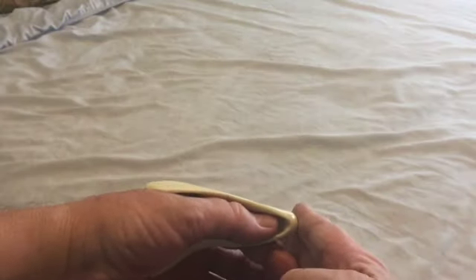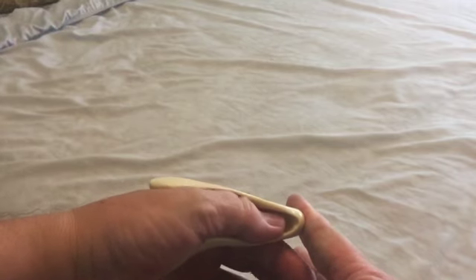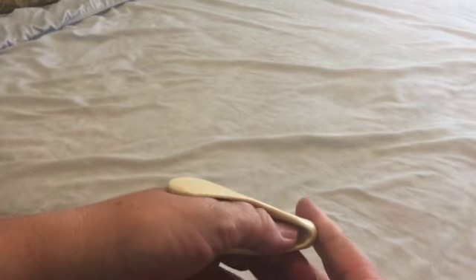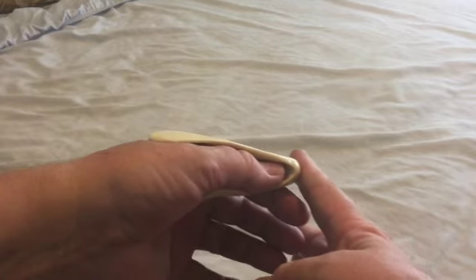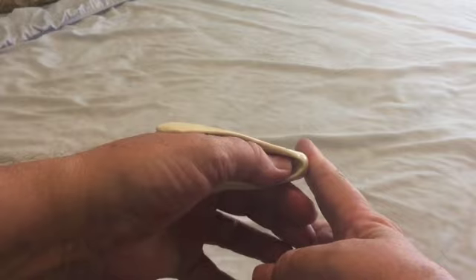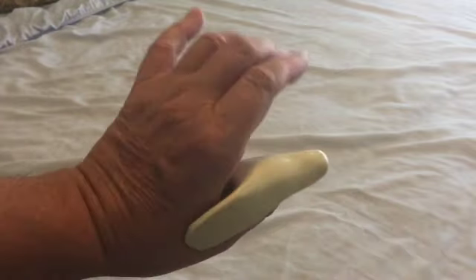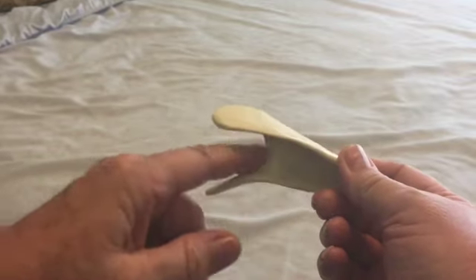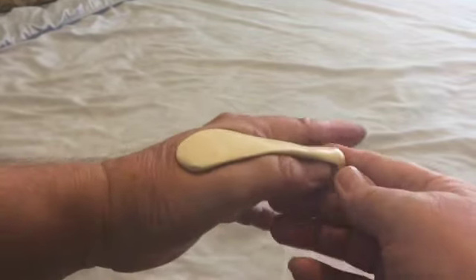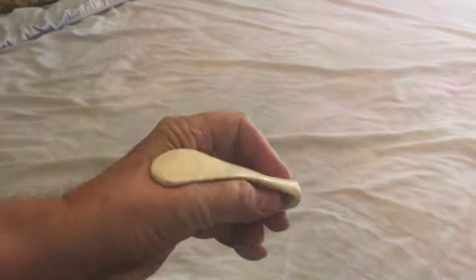If I push against something with my thumb, you can see the tip of my thumb isn't all the way there. If my thumb was the length of the tool, I'd be using my thumb to do the work — and there are many other tools out there that slide over your thumb and then you use your thumb to do the work. I don't see the point in that. So this applies all of the pressure right up here. The palm of the hand is doing all the work and your thumb is completely on vacation.